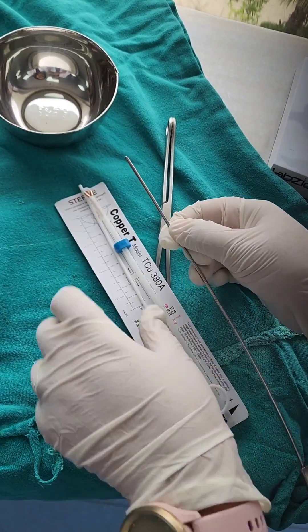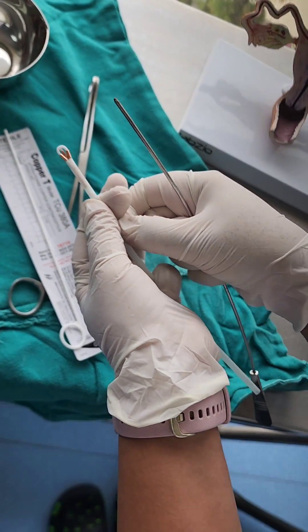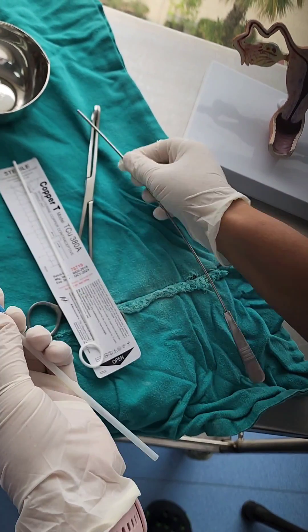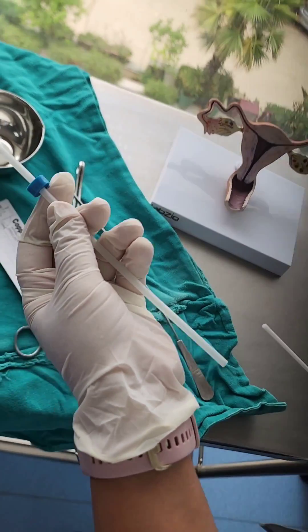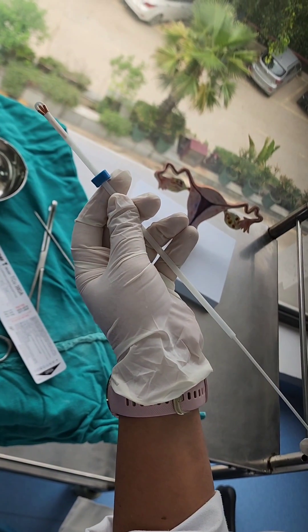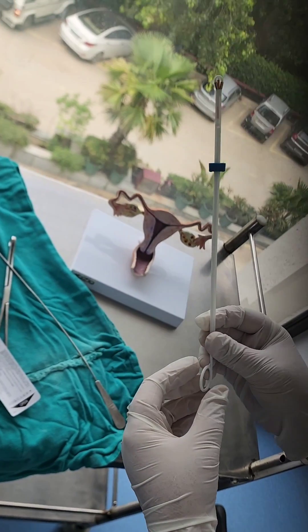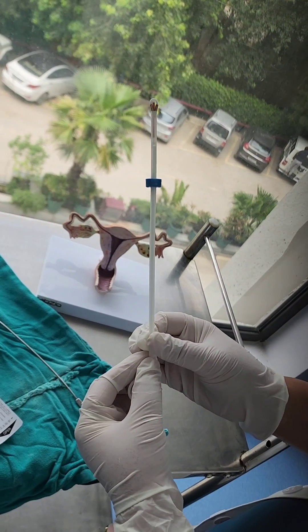We introduce the uterine sound, measure the utero-cervical length, and the same measurement is then adjusted on the blue marker of the inserter. We get the utero-cervical length set, and then introduce the plunger inside the inserter. We are now ready to insert the loaded copper T.